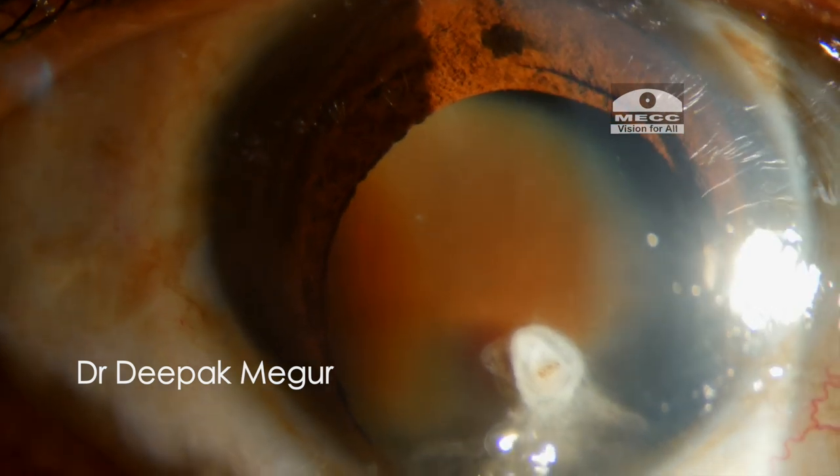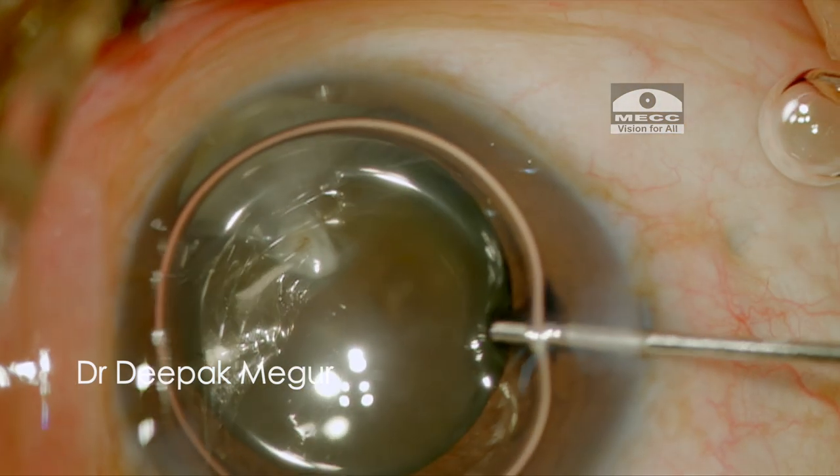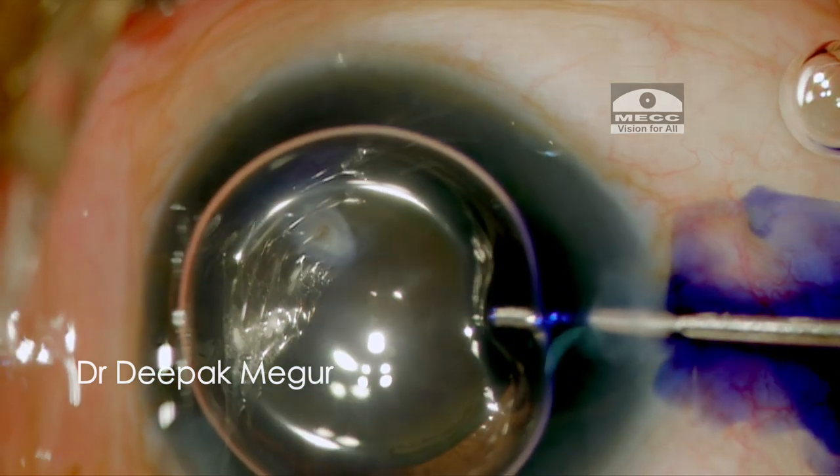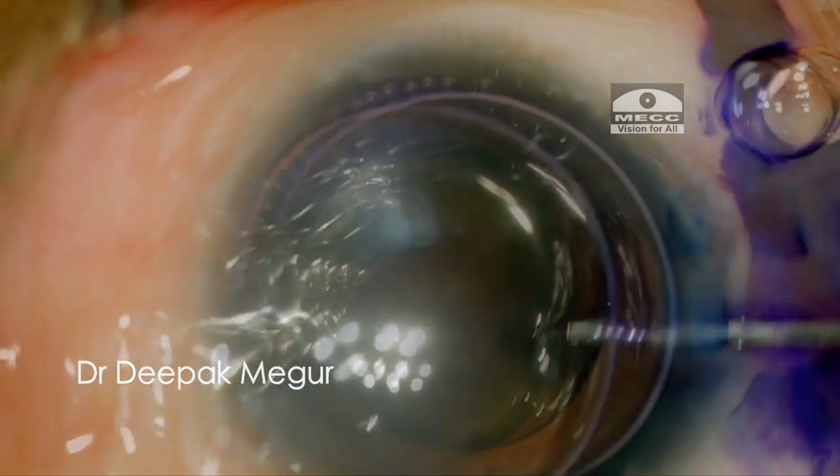My plan is to do a slightly larger incision by trying to work around this calcified speck. The capsule in these cataracts will be thin and flimsy, and especially in the quadrant of the coloboma, the anterior capsule is more vulnerable for tear and peripheral extension during nucleus manipulation.